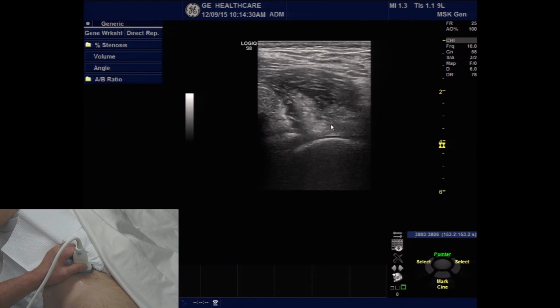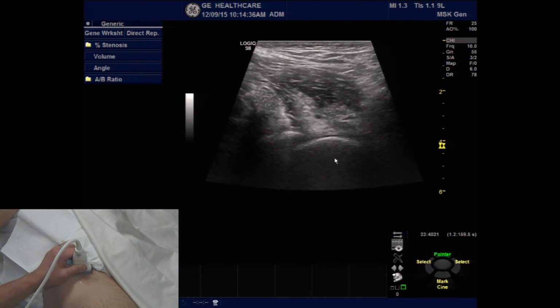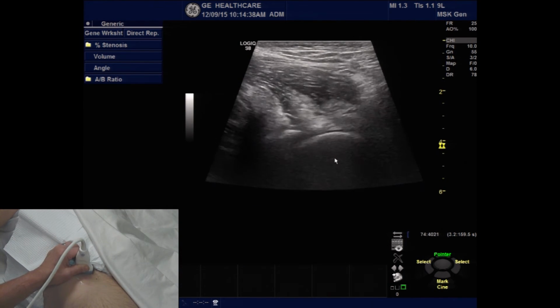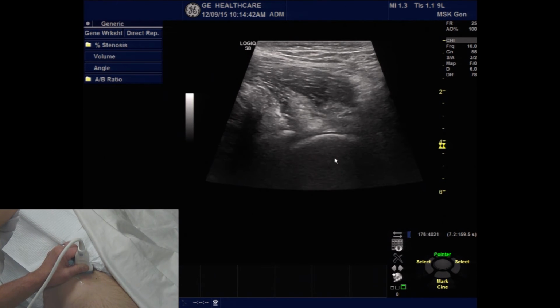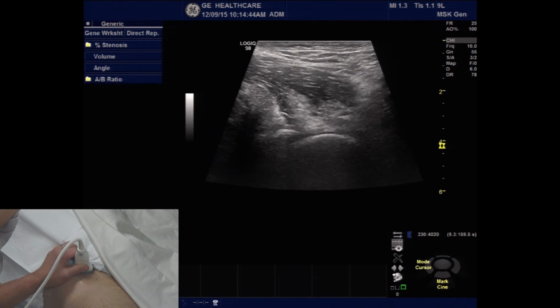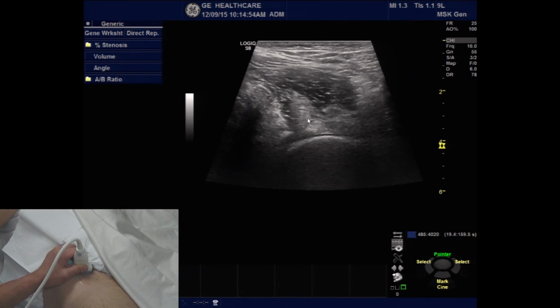Now, one of the techniques that really helps to give us a wider field of view is I can actually open up the transducer aperture using the virtual convex, which gives us a slightly bigger field of view and may assist us in following the needle from the more superficial portion as we come down onto the area of the conjoined tendon of the iliopsoas, sitting right here. Femoral head is our bone structure.